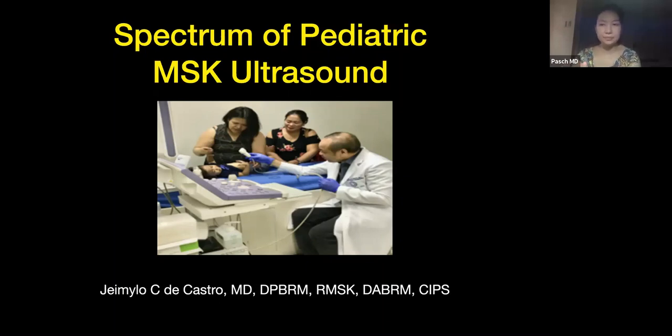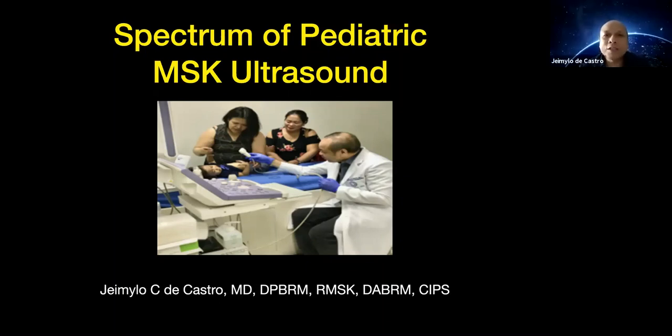So my topic for today is the spectrum of MSK ultrasound. This is one aspect of ultrasound which is rarely discussed. A lot of times we deal with adults, and it is very interesting to realize that this is a part of MSK that also needs to be studied and learned, knowing that we can also see pediatric patients a lot of times in our practice. So let me just discuss today the spectrum of pediatric MSK ultrasound.